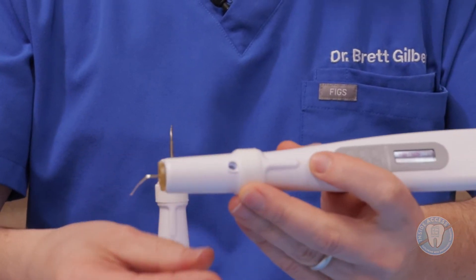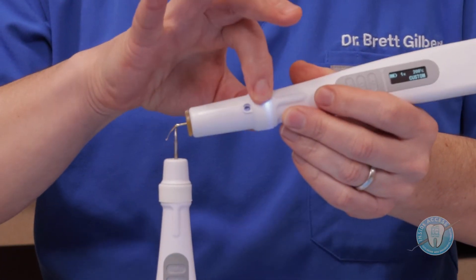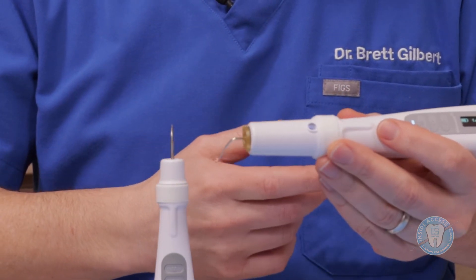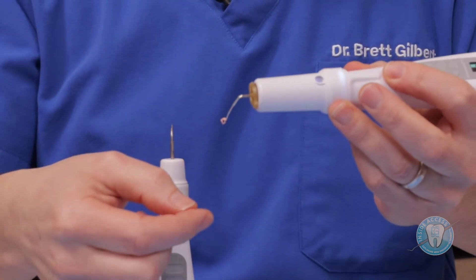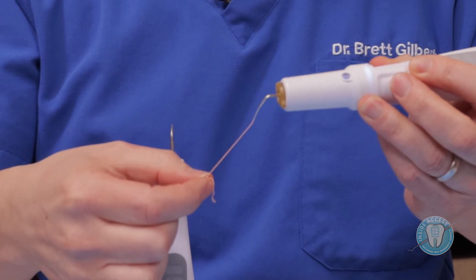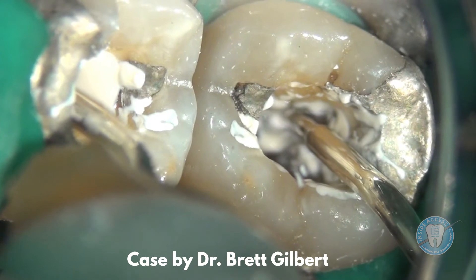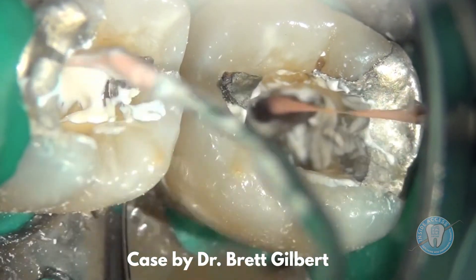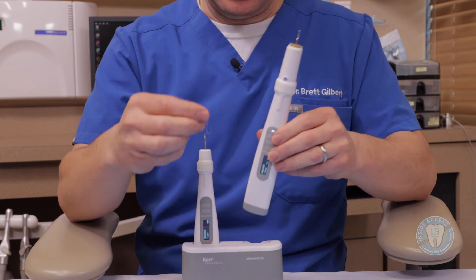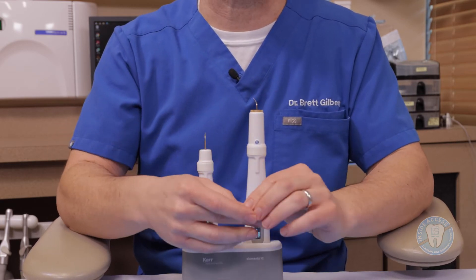Some other units require you to clean out the gutta-percha. Having this disposable cartridge — from which I typically can get one to two cases complete — is very helpful. It has a plunger that advances and pushes the gutta-percha out of the cartridge. As I press the button, with the 360 degree buttons you can apply pressure from any direction, and you're going to see this nice thermoplasticized, softened gutta-percha coming out. This is very nice to volumetrically fill the top part of the canal after your down pack. The Elements IC has a lot of nice advanced features and is worth exploring for your patient treatment.